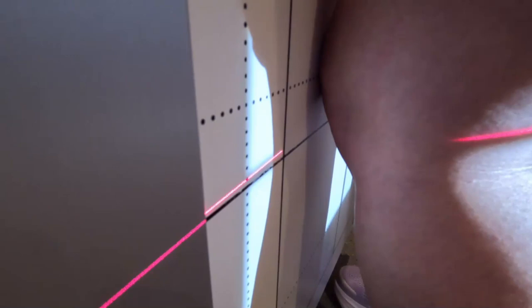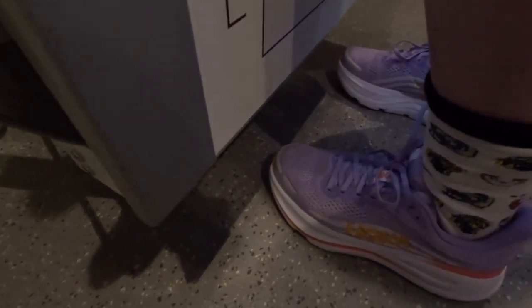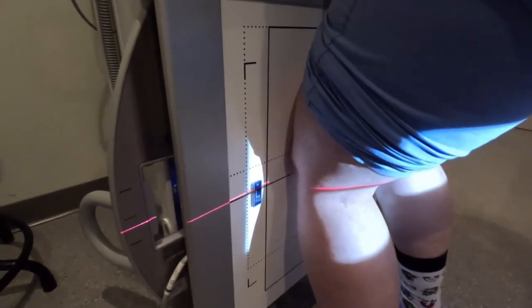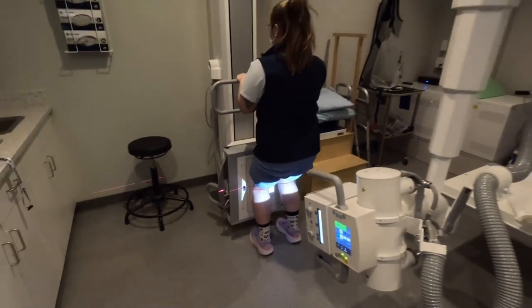You can see right here a good view of where that laser beam is exiting right at the apex of the patella. Pretty easy to see. So that leaves us only a couple things left to do here. Just make sure our feet are still pointed forward. Always double check positioning and then put our marker right there. Whatever one's closest to you, mark that side. And that's how it should look. Nice Rosenberg.